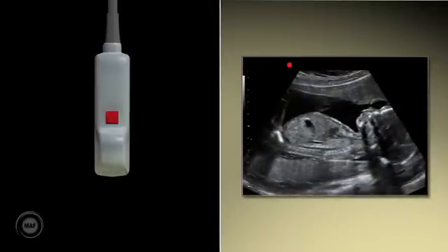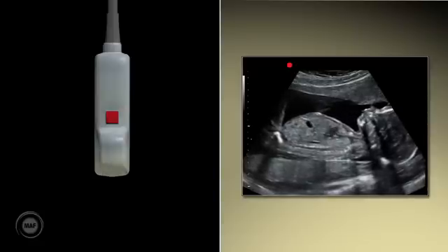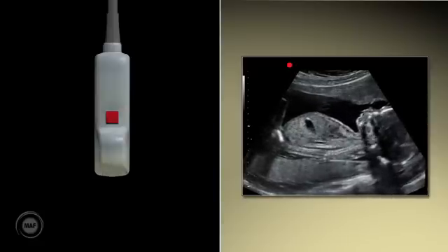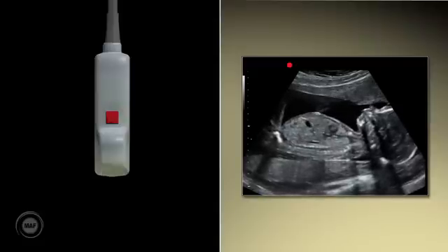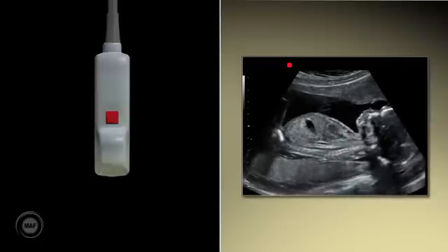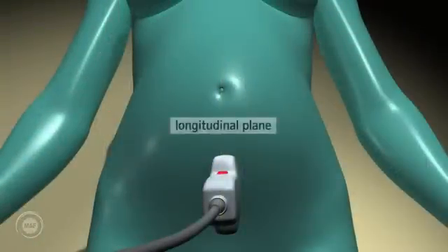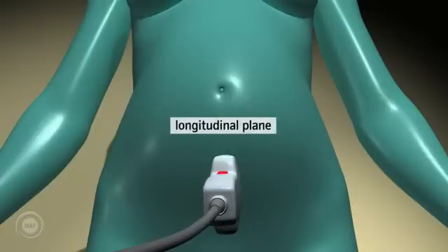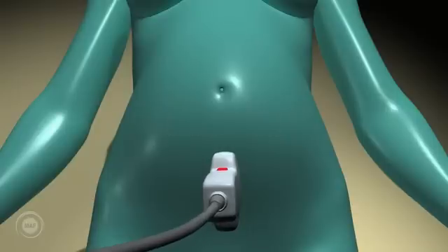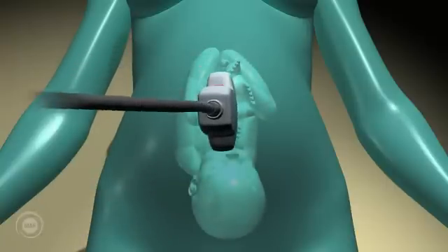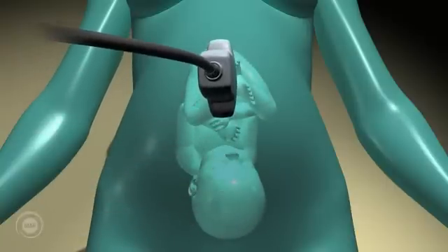Probe orientation. There is a marker or a dot located on the ultrasound probe, and it is always represented on the screen in the same place, usually the top left-hand corner. This dot is crucial when working out the orientation of the organ or the fetus, and when interpreting the corresponding image on screen. If the probe is placed on the mother's pubic bone in the longitudinal plane, one must consider where the dot is on the probe and relate it to the dot on the screen in order to interpret the image.